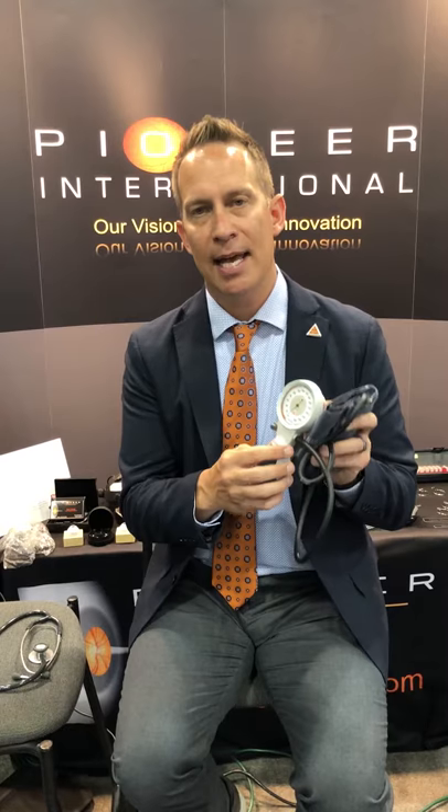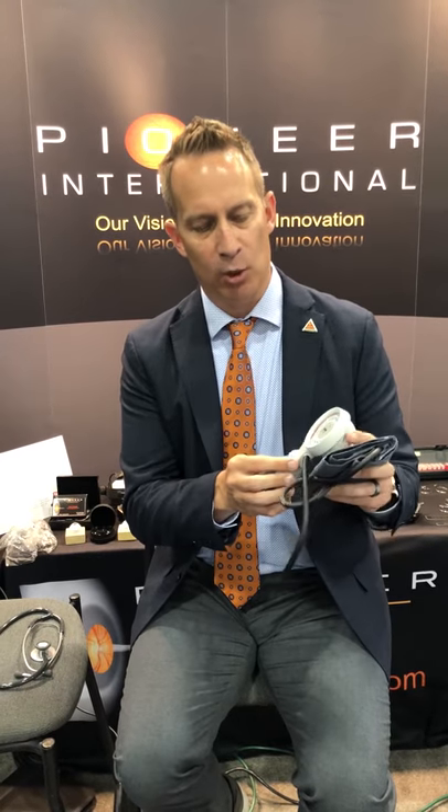Our G5 sphygmomanometer comes with a variety of cuffs. You can get it with a standard adult cuff, or you can also order it with a family practice kit that incorporates cuffs that will work with children up to large adults. In addition, it offers a lifetime calibration warranty and is shock resistant and incorporates an ergonomic design.